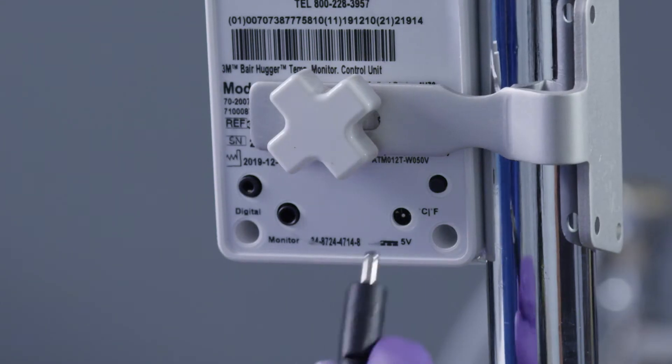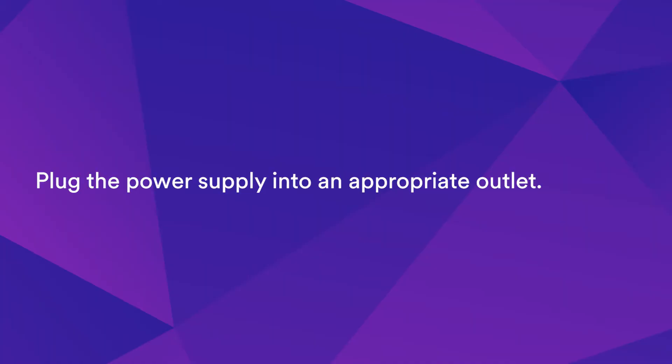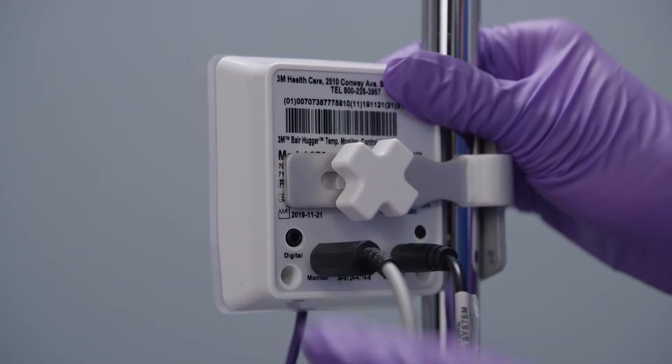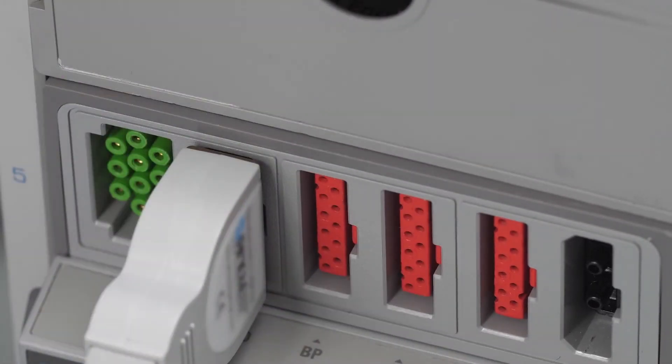Connect the power supply to the back of the control unit and plug it into an appropriate outlet. If desired, a monitor cable is available to connect the Bearhugger Temperature Monitoring Control Unit to the patient monitor. This may have already been done by the Biomed technician during installation. If utilizing this feature, ensure the cable is connected to the back of the control unit and to the temperature input on the patient monitor.